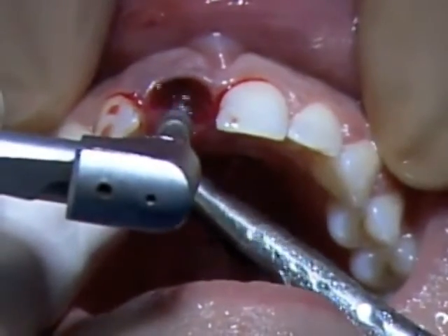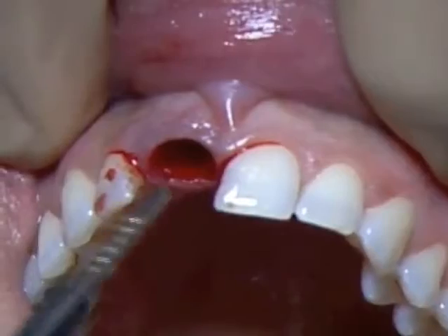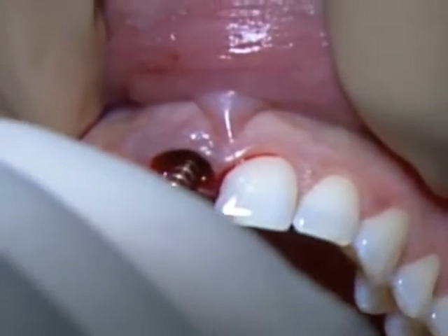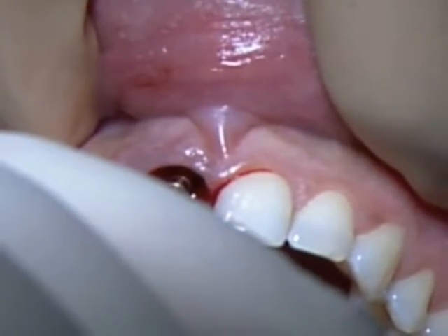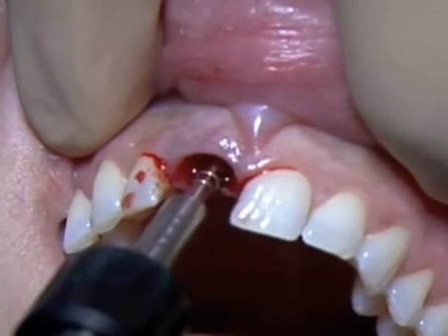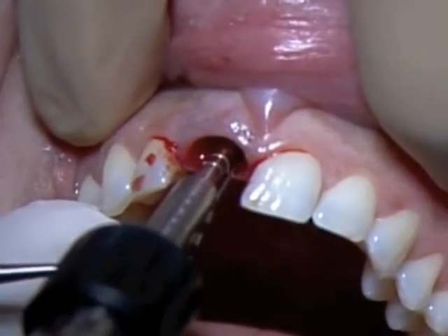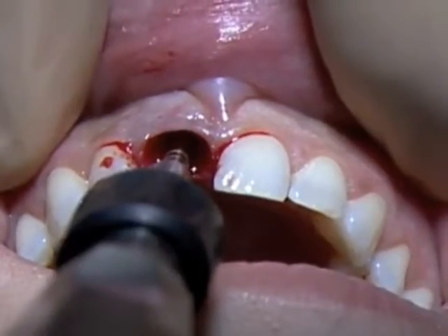You see here we will change the inclination towards the pilot, and once we have completed, we will use a 2 to 2.7 osteotome from Stoma in order to have a better primary stability with our implant. We then check the level of the bone with our probe, and if we need, we can go deeper.